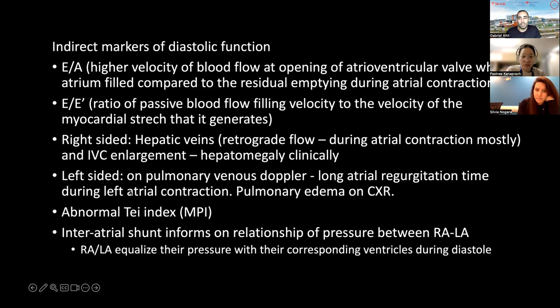If you start having diastolic dysfunction, you can start looking at things like pulmonary venous Doppler. So you get something called the long atrial regurgitation time during the left atrial contraction. And often these patients with severe LV diastolic dysfunction will get pulmonary edema on chest x-ray. For example, babies who have been exposed to very prolonged steroids or infants of diabetic mothers, who have severe LV hypertrophy, their ventricle is very stiff. These patients will present with pulmonary edema, fluffy lungs.